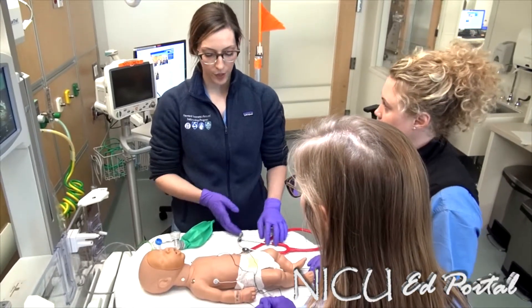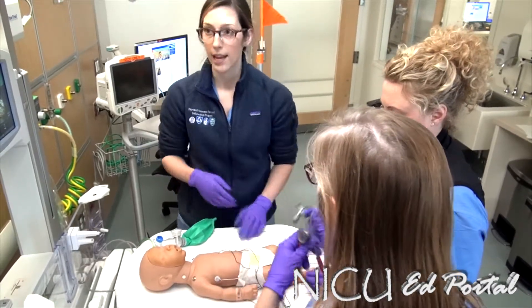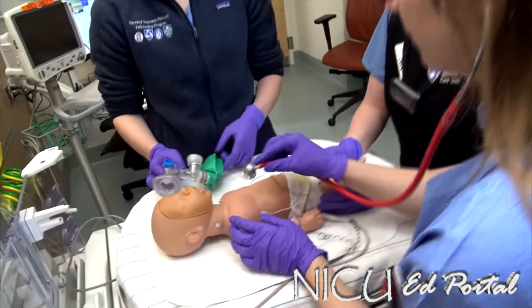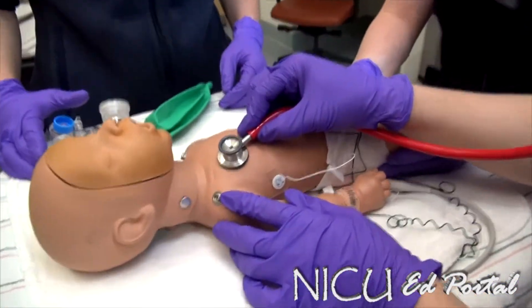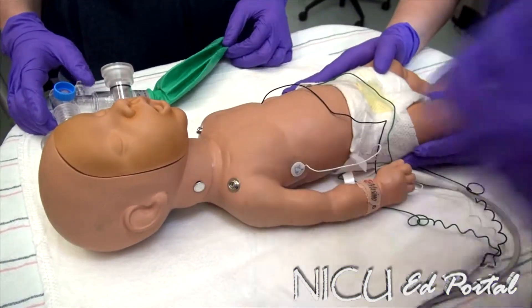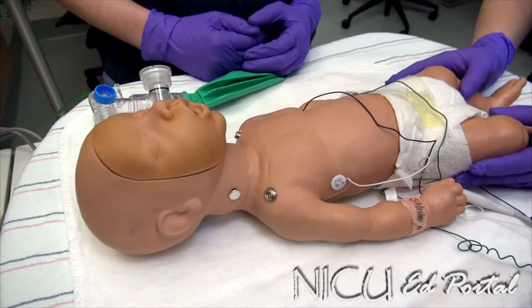We come to the baby and the first thing we want to do is listen to the breath sounds after we've noticed some vital sign changes. I have unequal breath sounds on the left chest — diminished.